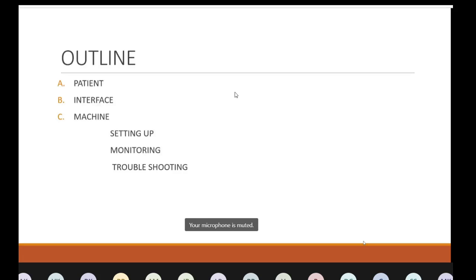Just to understand that difference. Okay. Yeah, great. So how do you start NIV for a patient? It is always better to keep the patient in a sitting position because the diaphragm works better, so that the patient is able to breathe better. So the position is very important.